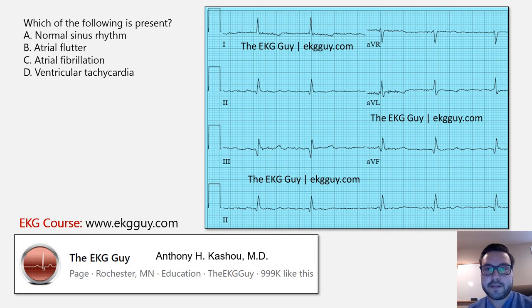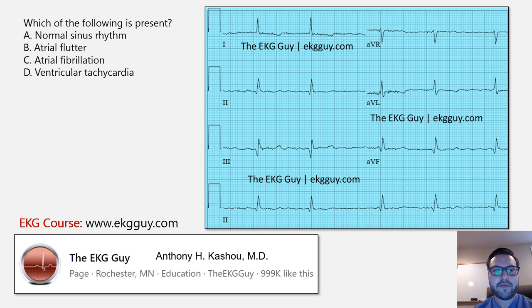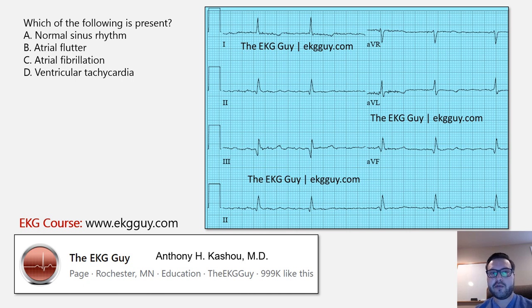Welcome to the EKG Guy. We're going over a posted question to make sure everyone's on the same page. The question asks: which of the following rhythms is present? The options are A) normal sinus rhythm, B) atrial flutter, C) atrial fibrillation, or D) ventricular tachycardia. You have this EKG here.